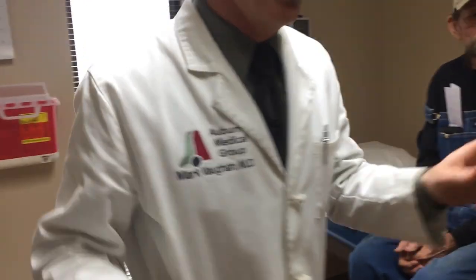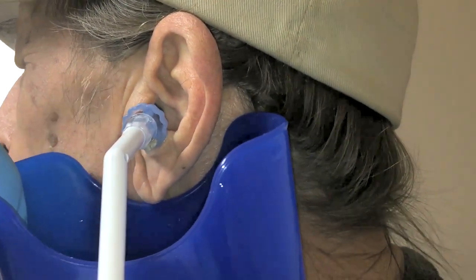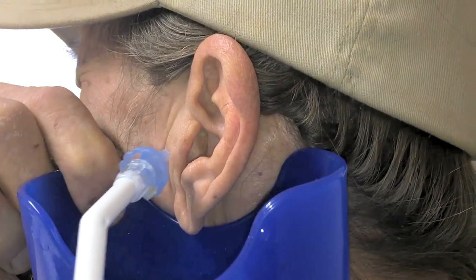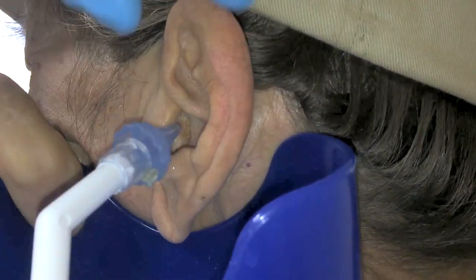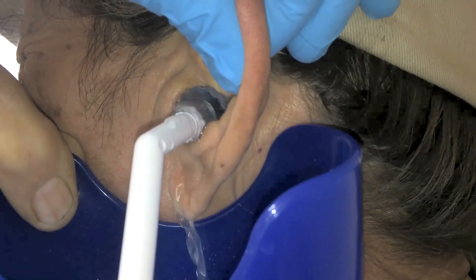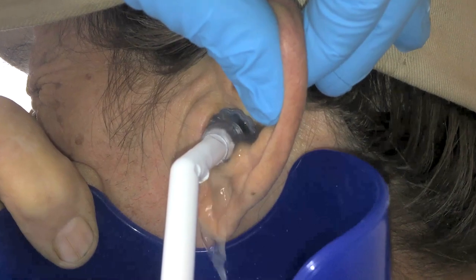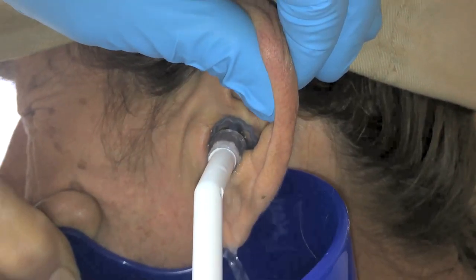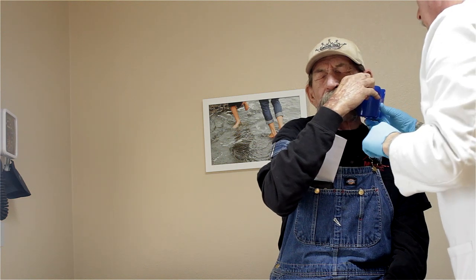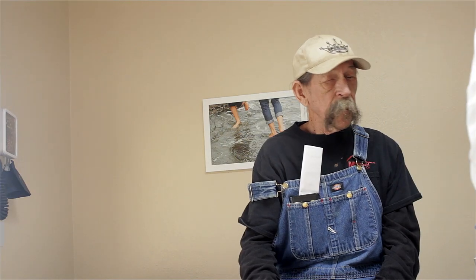You know what, I'm going to put gloves on because I saw a spot of blood. Can I have you hold it just right here at the top? There we go — that way I can get as close as possible so the siphon will work as long as possible. You've got the full tank that time. Let's look — heck yeah, let's see where we are.